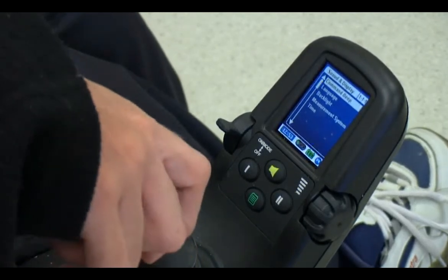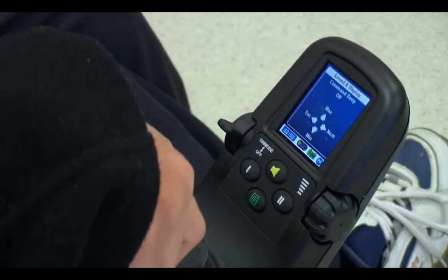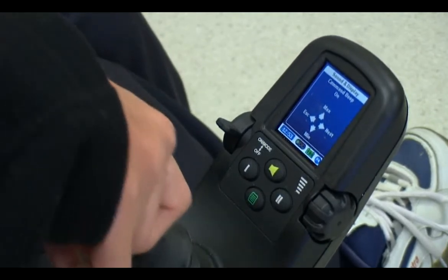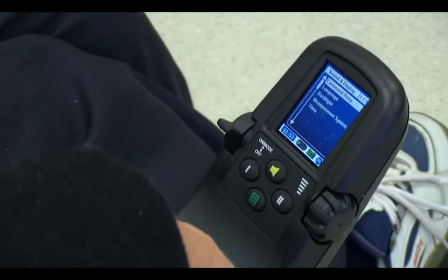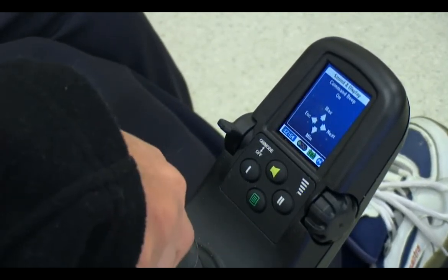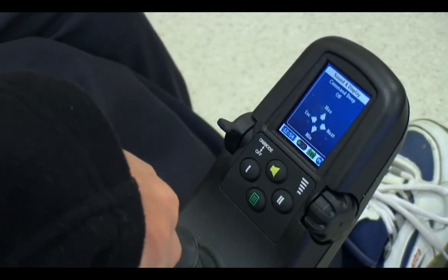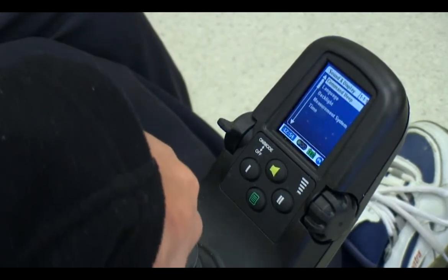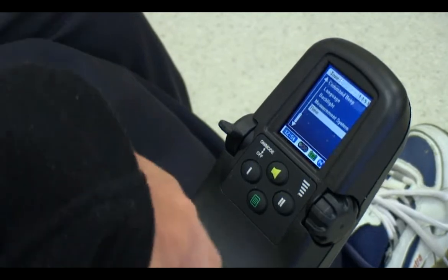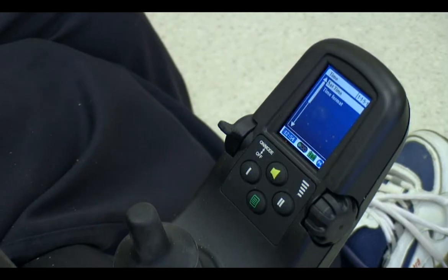So if I go in here, I can turn the beep on — so now I have the beep — or I can turn it off. We can turn the timer off. We can set the time format, so that's 24-hour time.